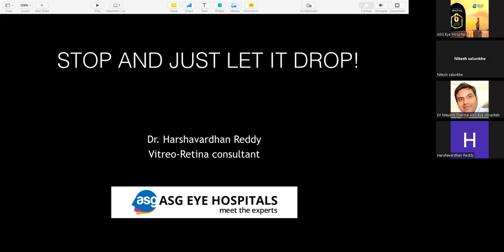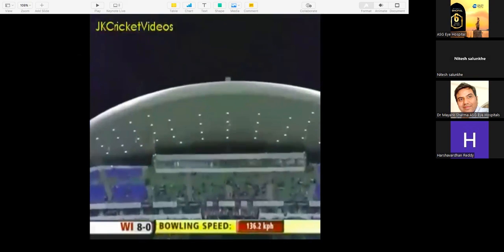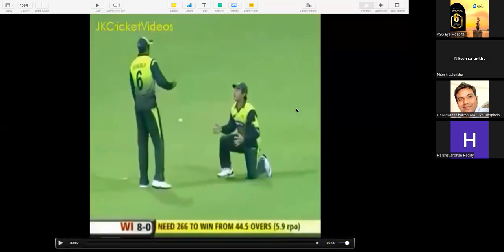Good morning, everyone. Today, I'm going to be talking about nucleus drop, and I'm going to try and include everything from cortex to nucleus to IOL and everything else you can find and drop into the vitreous cavity during a cataract surgery. So if there's one thing that I would want you to take away from today, it would be: if you have a PCR and you notice a nucleus sinking, I think the reflex usually is to somehow immediately pull that out, but that can be very detrimental to your patient. So you should avoid that. So if the nucleus is dropping, what do you do? You just let it drop.